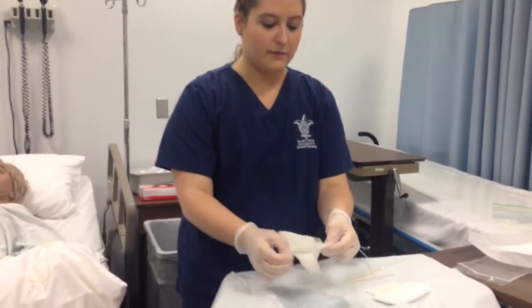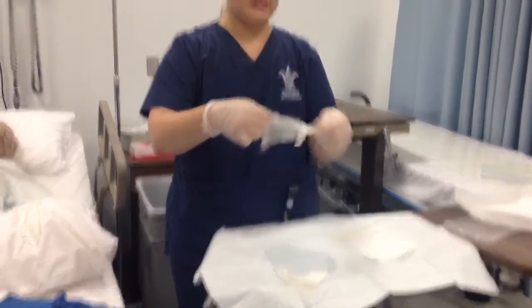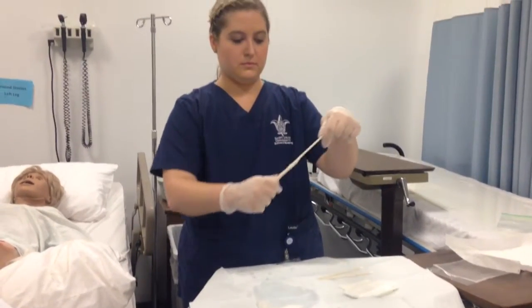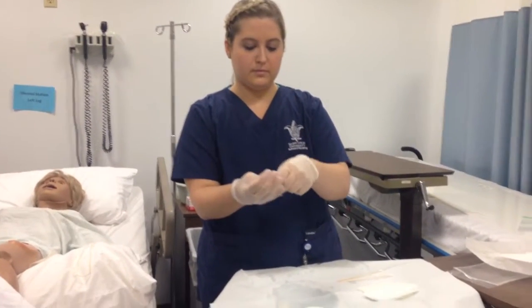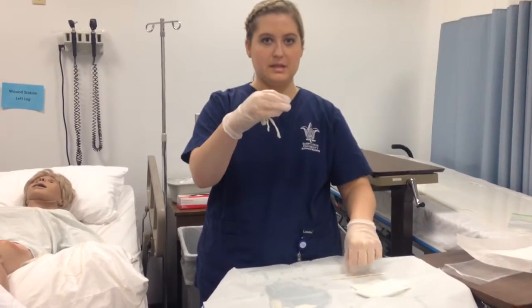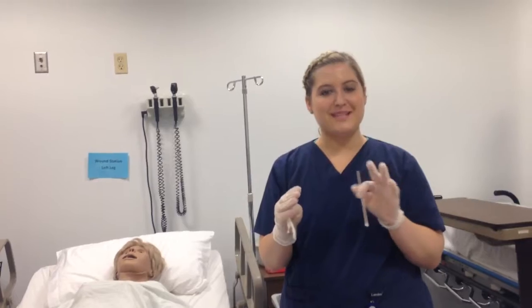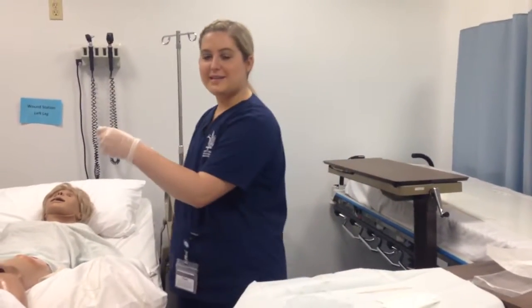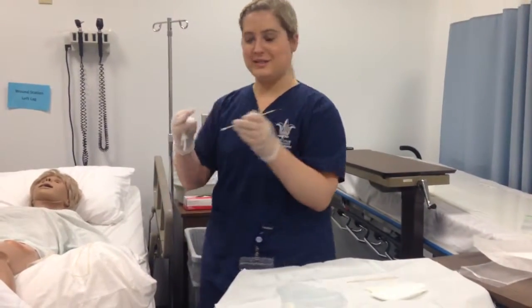I take one of my 4x4s and I completely unravel it. And then I put it in my palm, leaving just a little bit out. And I take my Q-tip. I did make one mess up, I'm sorry. Before I would pack the wound, I would take the Q-tip and put it inside the depth of the wound, and then I would break a piece off and measure it later. Okay, continuing to pack the wound.